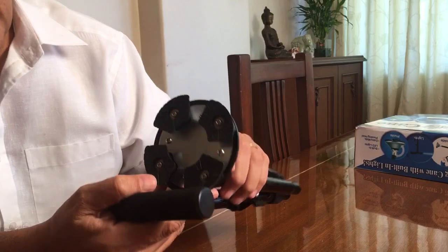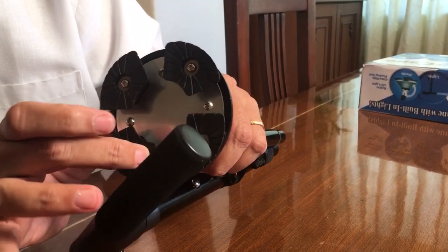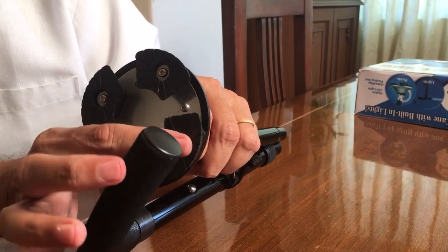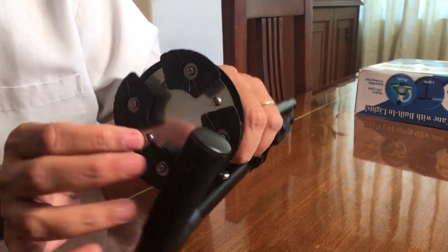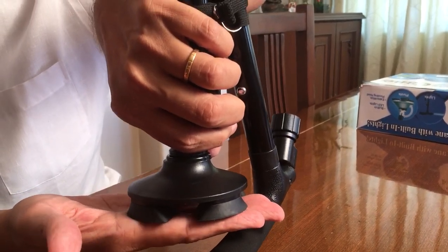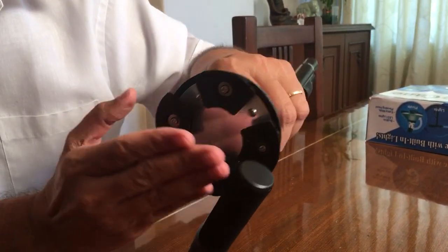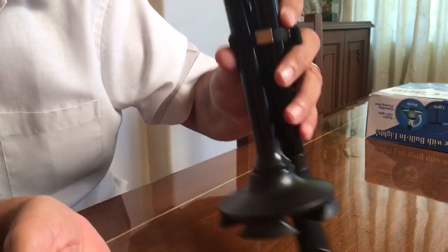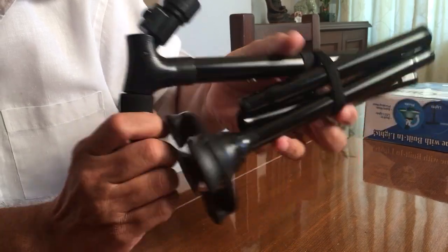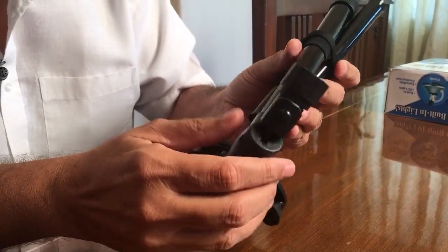The third feature: if you look at these three or four pivots, these are the legs which are made of hard rubber. This gives the feature of a standalone cane and you don't have to look for places to hang your cane — it will just stand by itself. Even the handle is of soft rubber.